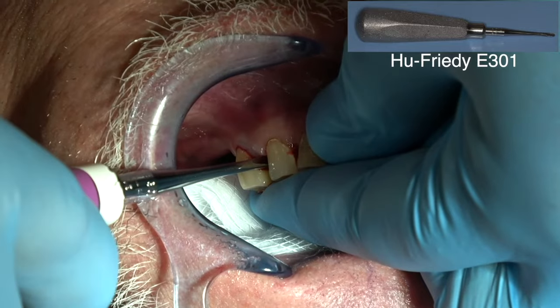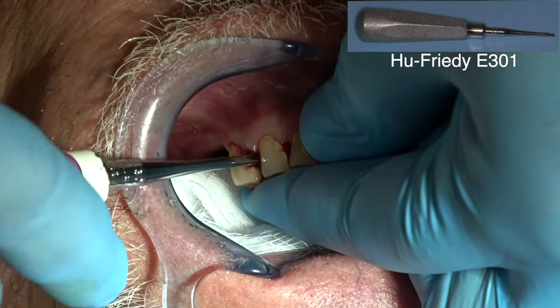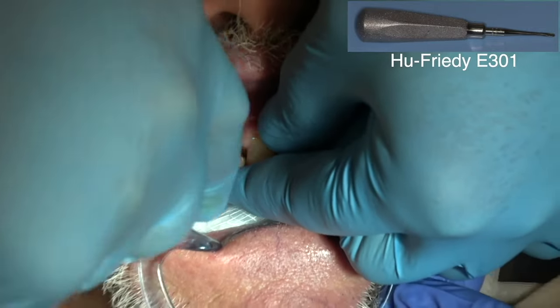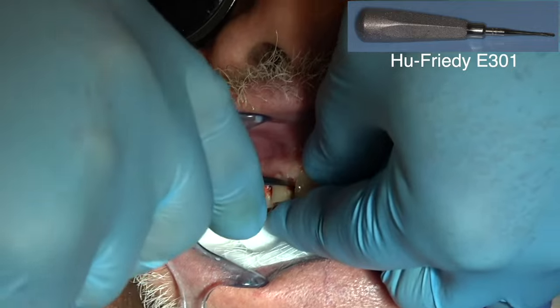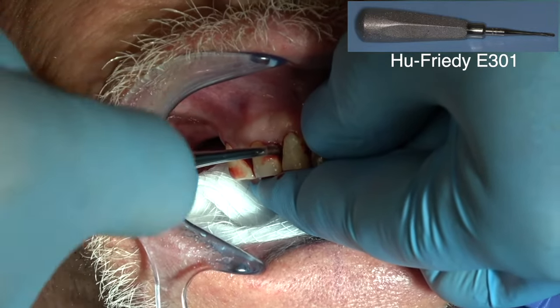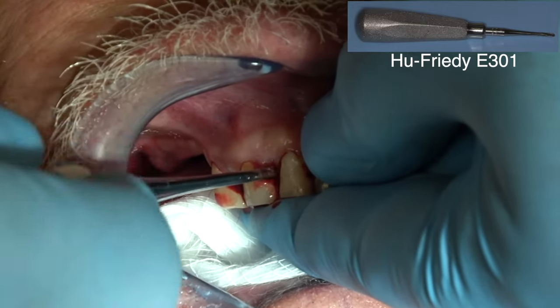Just move them mesial-distally. I want to preserve the facial bone, so I want to extract the teeth straight out of the socket. I don't mind if I'm loosening a little of the bone proximally, but I want to preserve the facial and the lingual or the palatal bone.